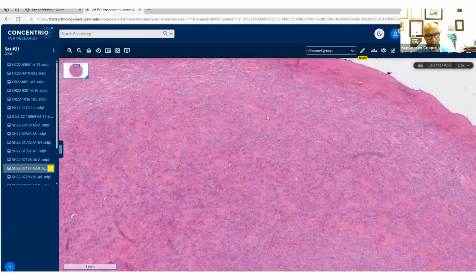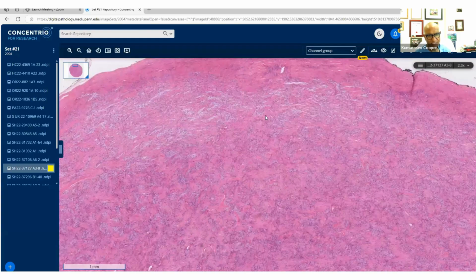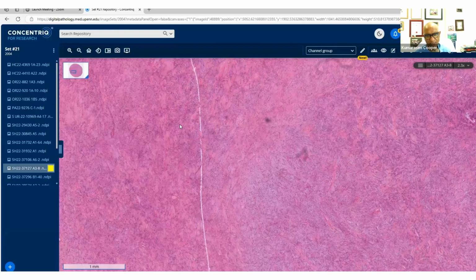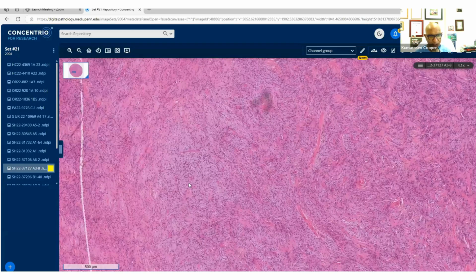It's always neat to pick up those, and you can pick them up on a low power pattern as well. Here we see the pattern pretty much the same all over. There isn't any change in the morphology or the pattern. So it's very uniform and unlikely to be sort of hybrid.